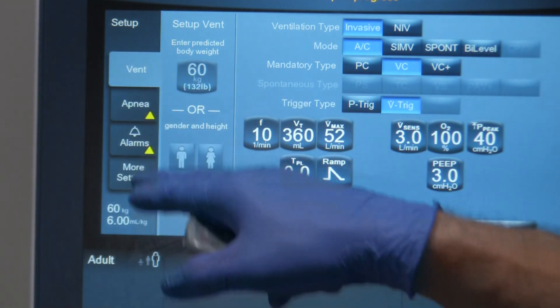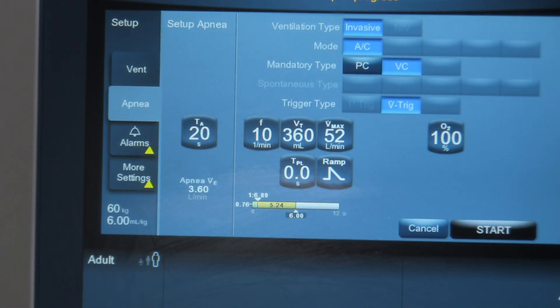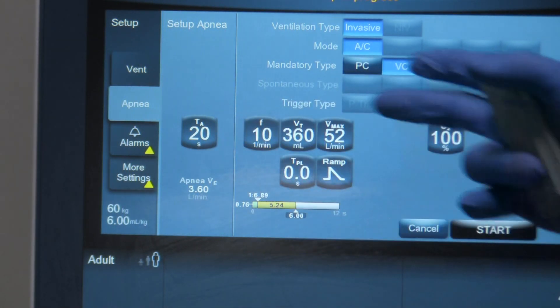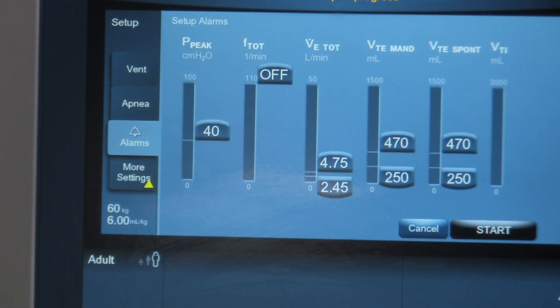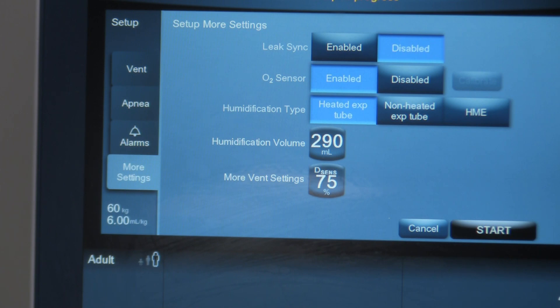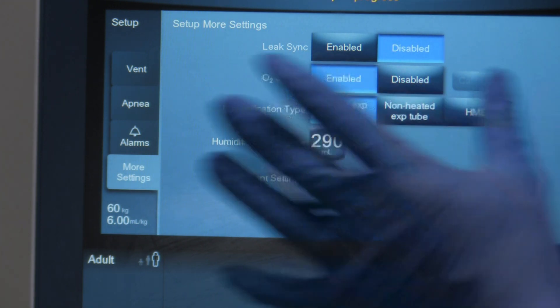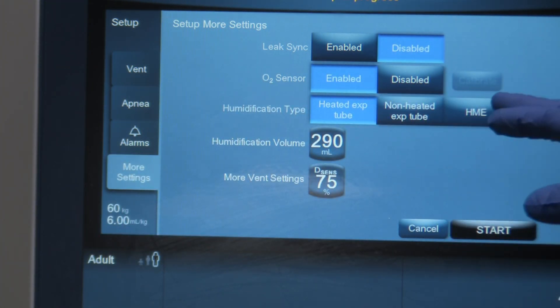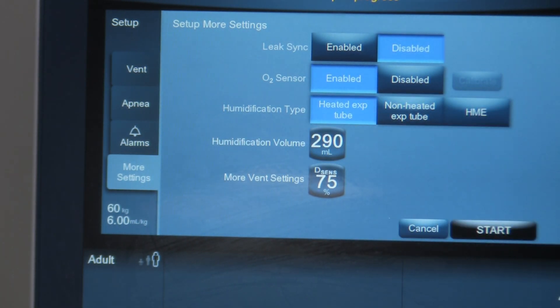On the side of the ventilator we have apnea settings — if you're in a spontaneous mode you can program the apnea time and choose backup parameters. We have our alarm window, and it's always important to make sure your alarms are set appropriately — especially the high pressure alarm — before initiating mechanical ventilation. There's also a more settings tab that allows you to configure humidification, change the circuit type, and choose options like HME, non-heated expiratory tube, or heated expiratory tube.